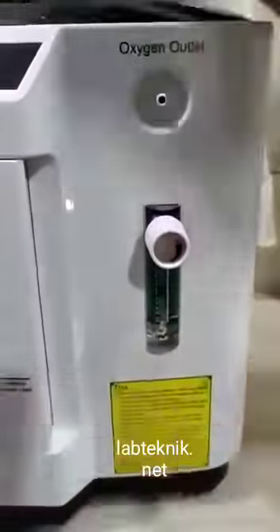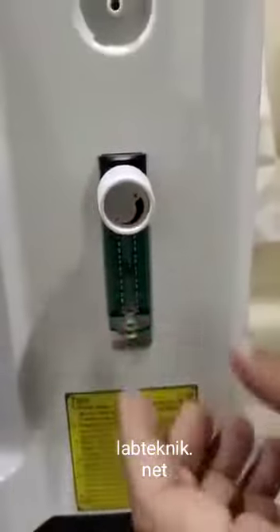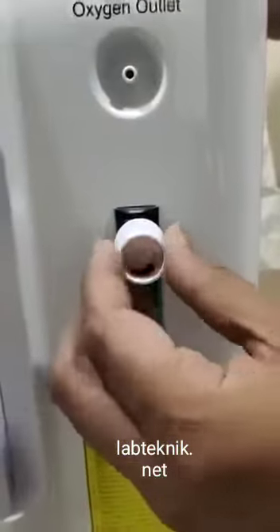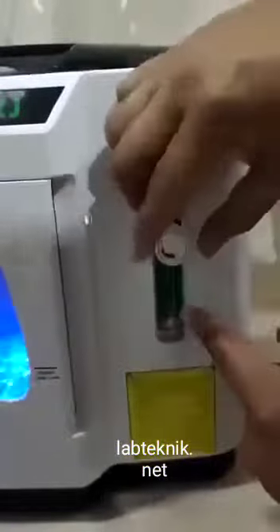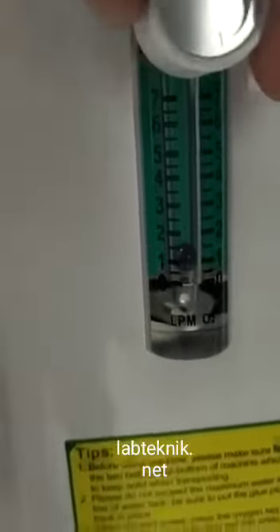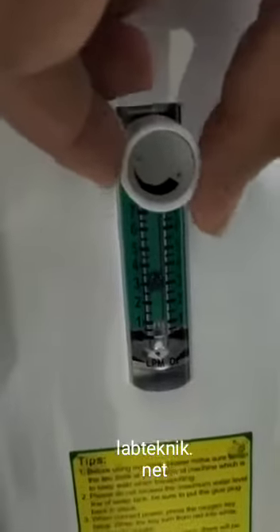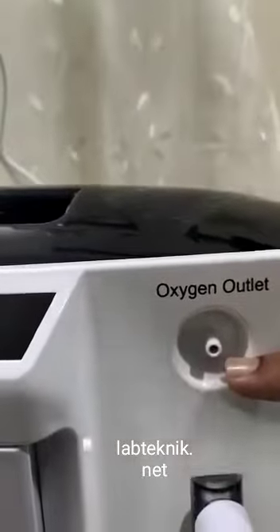Now you can see the oxygen is getting generated. Here is the knob to adjust the flow of oxygen — rotate to increase or decrease. If I rotate it to reduce, it goes down to 1 liter per minute. If I increase it, it comes up. This is where the oxygen will come out.